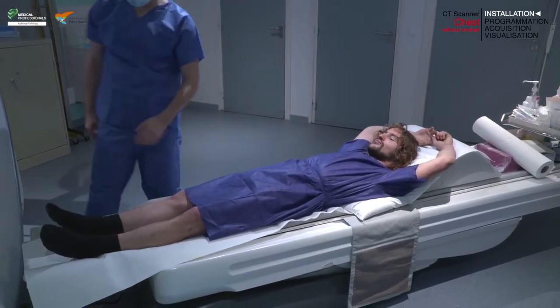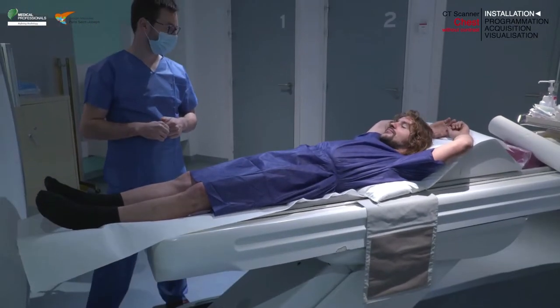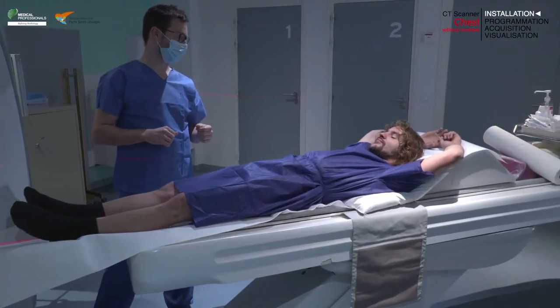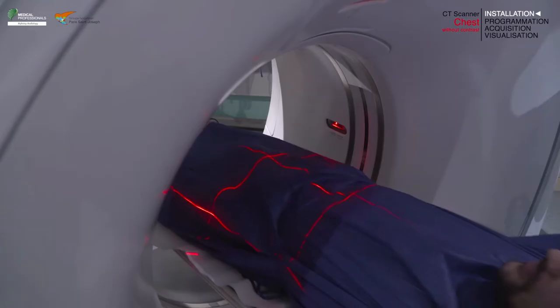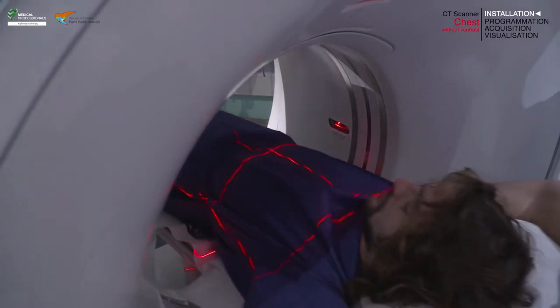For your patient's comfort, you can place a pillow or an inclined plane under their head. You could also place a leg elevation pillow under their legs.